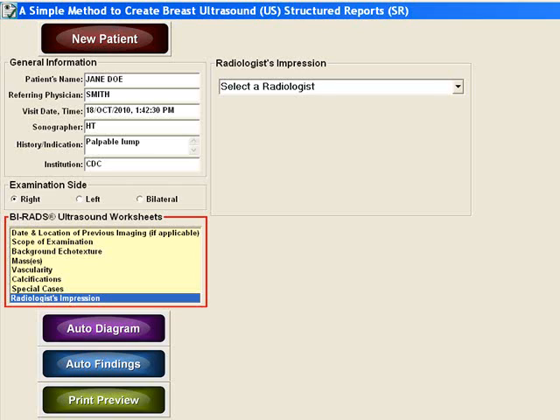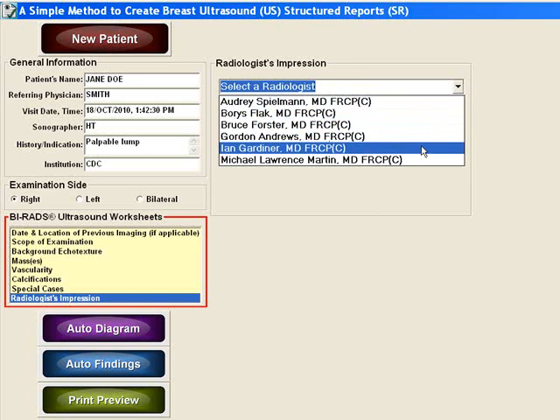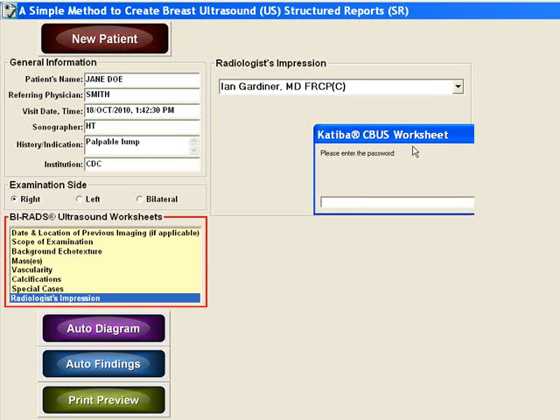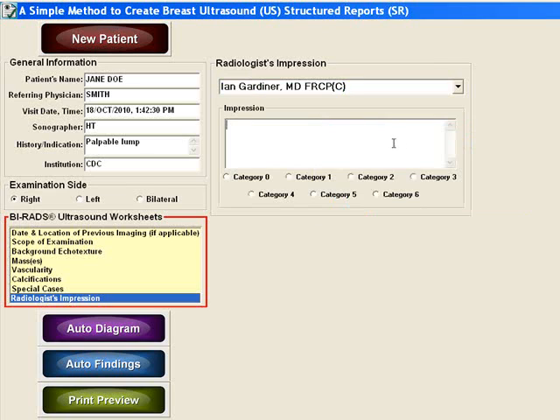All information thus far has been entered by the technologist. The technologist's worksheet can now be printed as a preliminary report, or the radiologist might want to add their impression at this point — this is the only information the radiologist must enter. Select the radiologist's name from the drop-down menu, enter the password, and then enter the final impression and recommendation, either by typing or voice recognition.